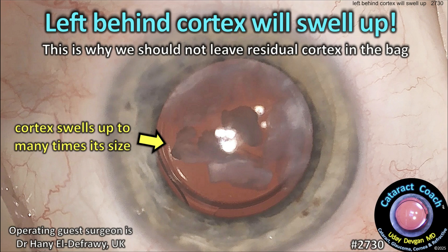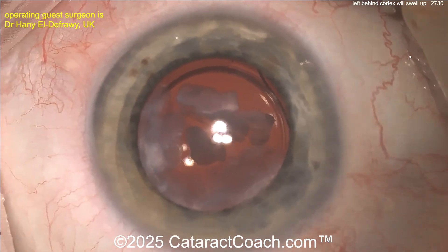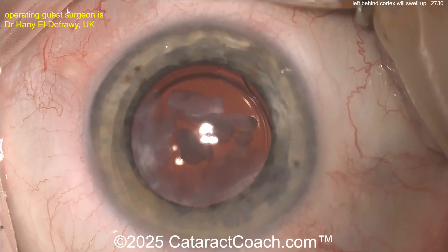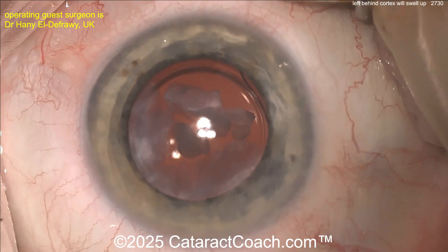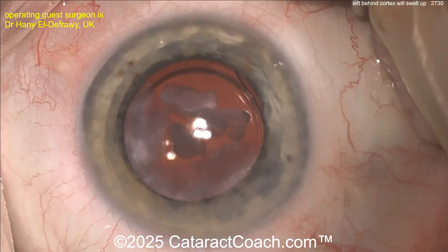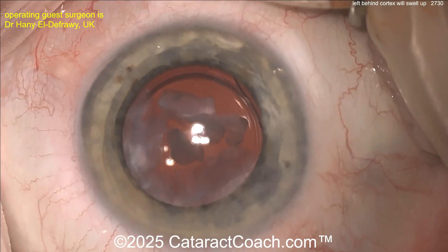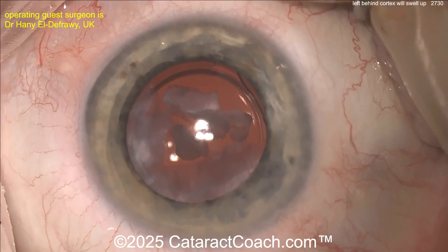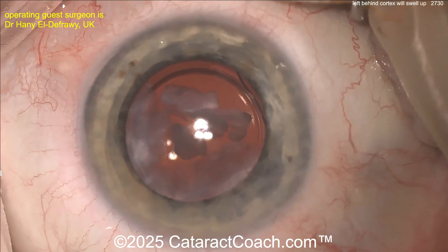Left-behind lens cortex will swell up — this is why you should not leave residual cortex in the capsule or bag. It swells up to many times its size. Here's a patient referred to our guest surgeon. The original cataract surgeon thought there was some cortex remaining that was hard to get out, so they left it alone. This is what happens: the cortex, the lens material, the lens proteins swell up with time and with BSS.